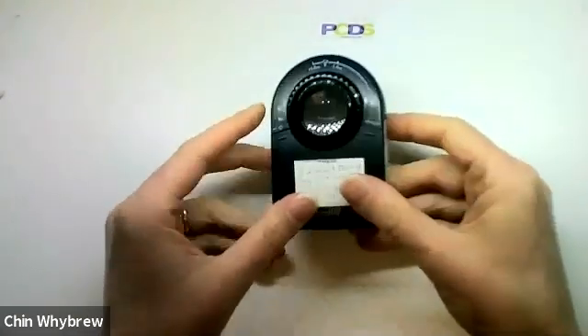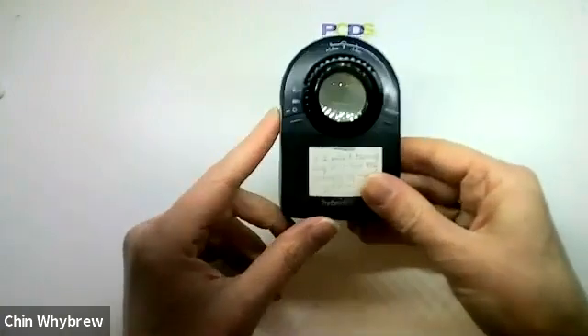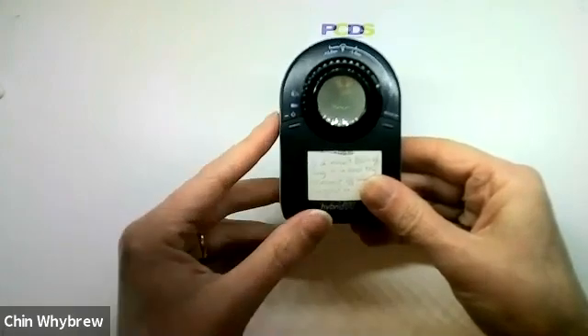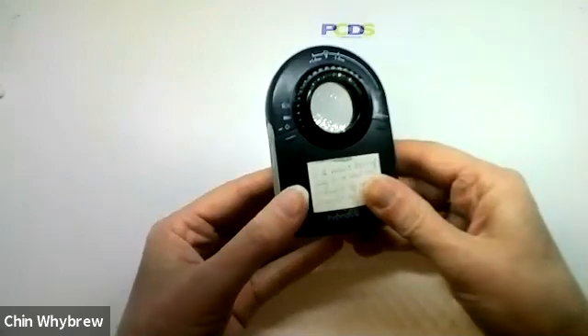What we have here is a scope. You can see there is an on/off button on this side, which is labelled, although it's quite small, and that will turn it on. There's the light has come on.